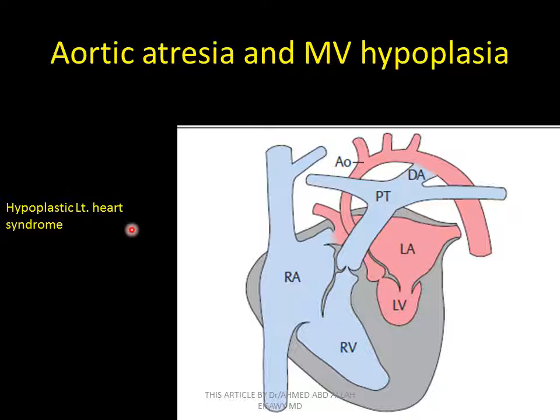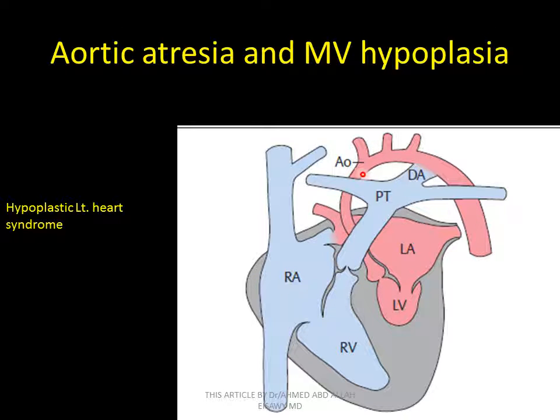Aortic atresia with mitral valve hypoplasia — hypoplastic left heart syndrome. This is aortic atresia — the aorta is diminishing in caliber, seen as an atretic aortic valve. Aortic atresia and mitral valve hypoplasia: hypoplastic mitral valve — hypoplastic left heart syndrome.